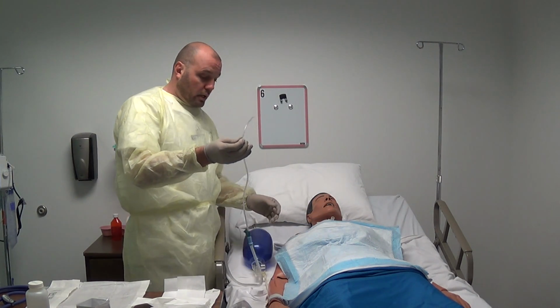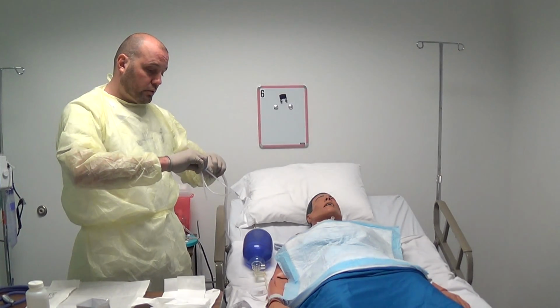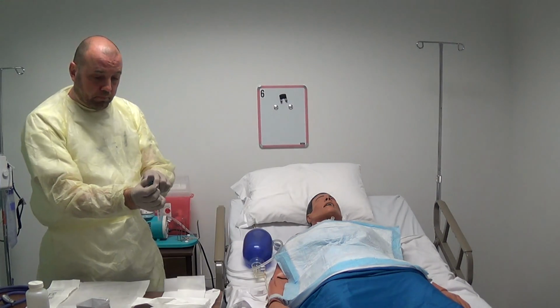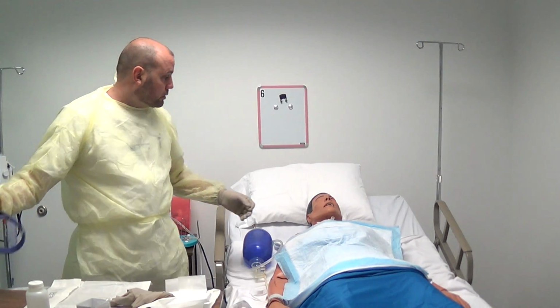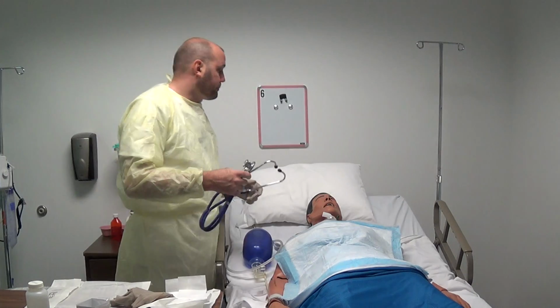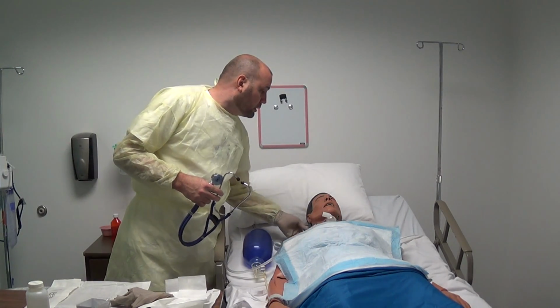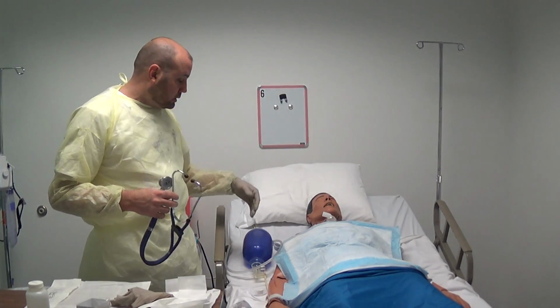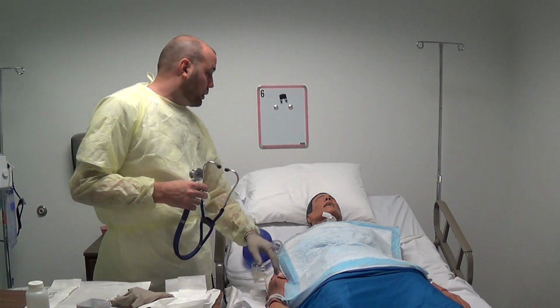Okay. At this point, I can discard the suction tubing. I want to do a complete lung assessment again on the patient. Mr. Smythe, you feeling okay? I'll listen again to the anterior and posterior of the lungs. I can tell that he's breathing much more clearly now without the congestion, and that his pulse ox is up to 96 at this point.